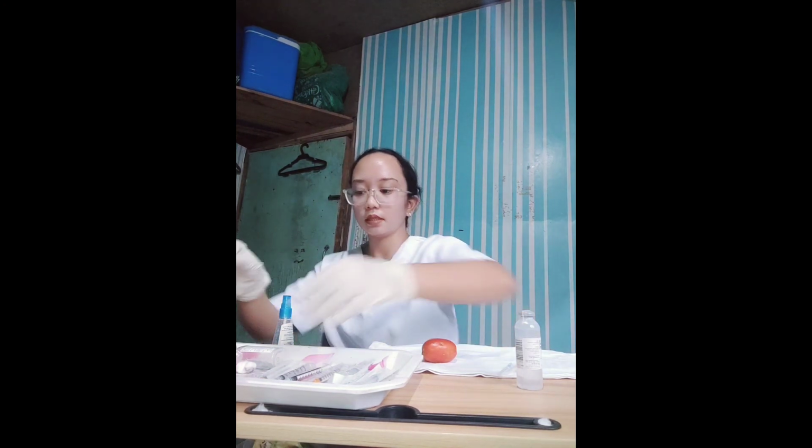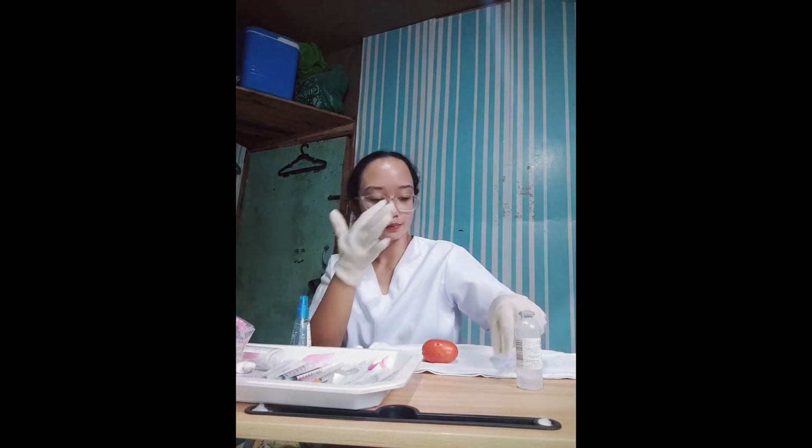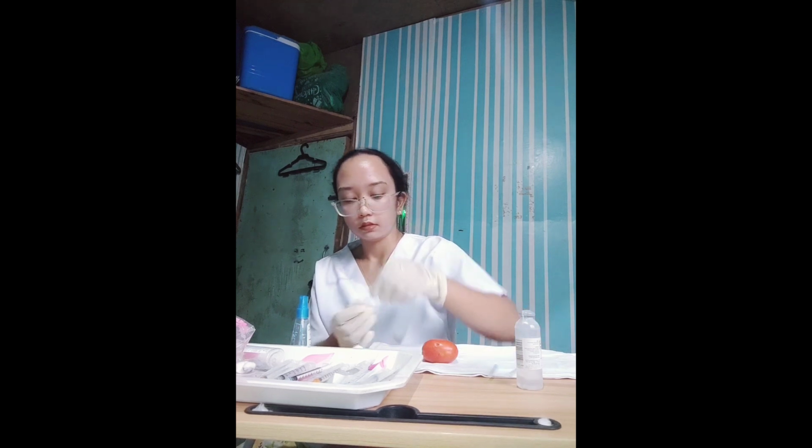So next we will cleanse the skin at the site using a firm circular motion, starting at the center and widening the circle outside to prevent exposure to contaminants. So the intradermal should be a 10 to 15 degree angle.